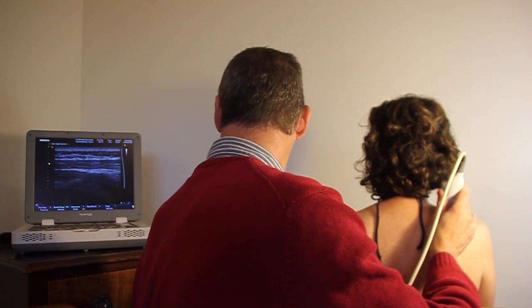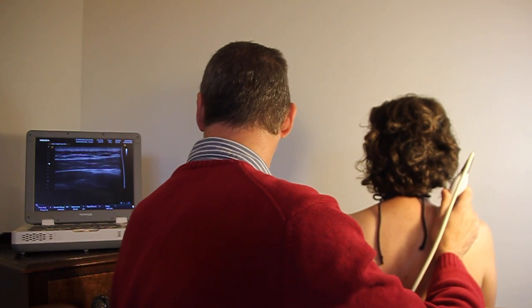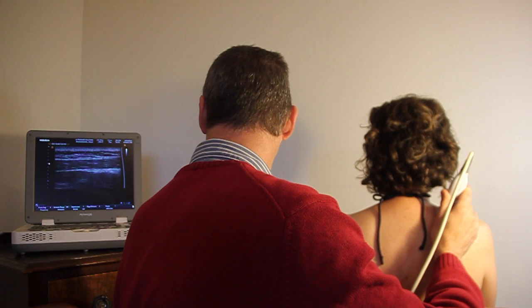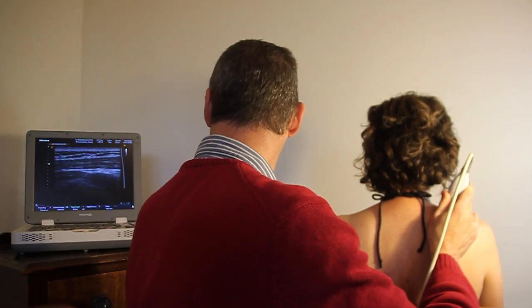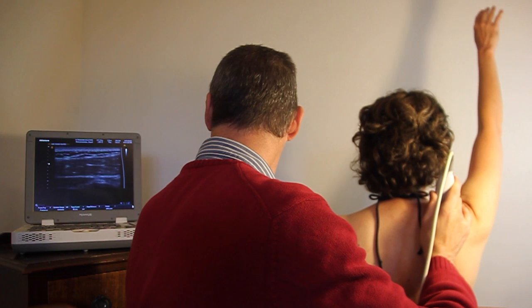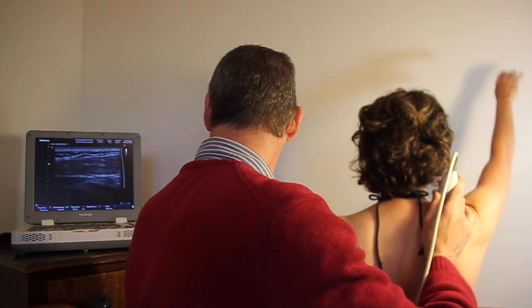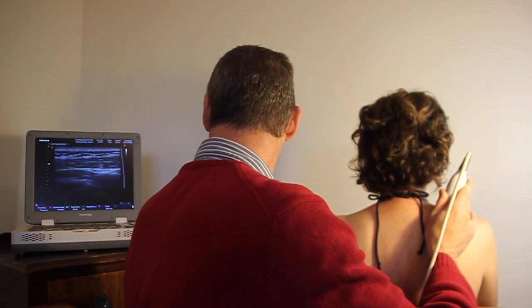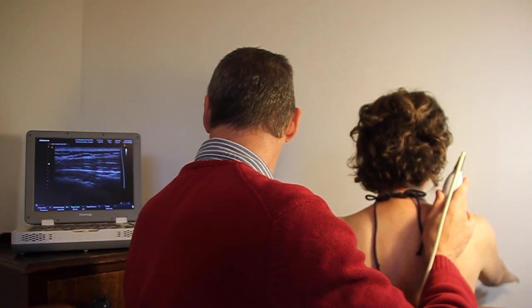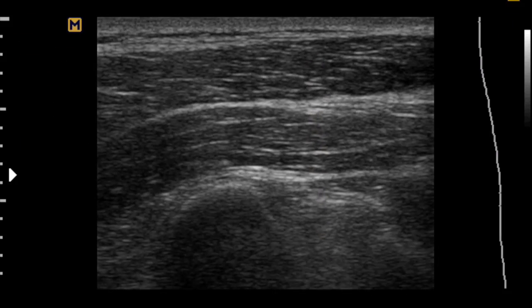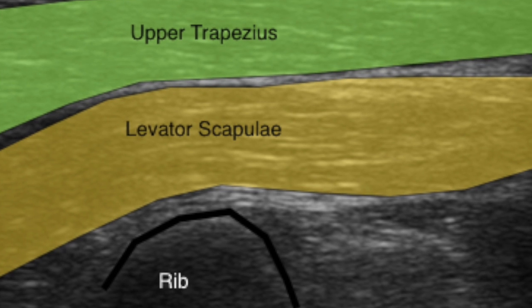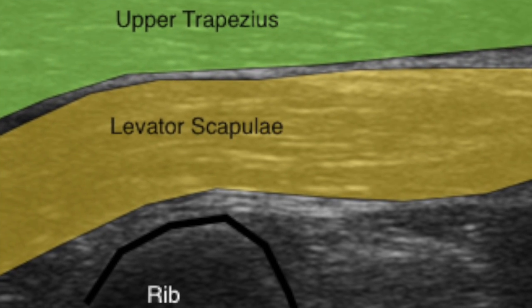Scan the upper trapezius muscle just medial to the suprascapular notch. Now assess the degree of upper trapezius and levator scapula muscle activity during arm elevation, and again determine at which stage of elevation the thickening occurs. The upper trapezius is seen here at rest with the levator scapula muscle underneath and the first rib under this.